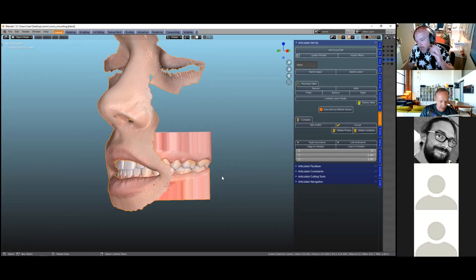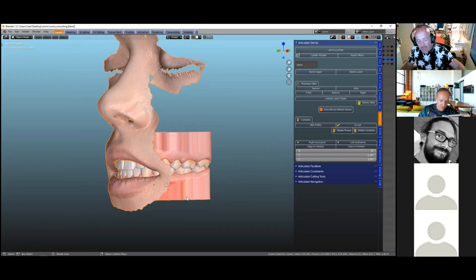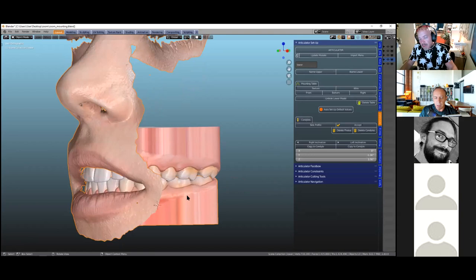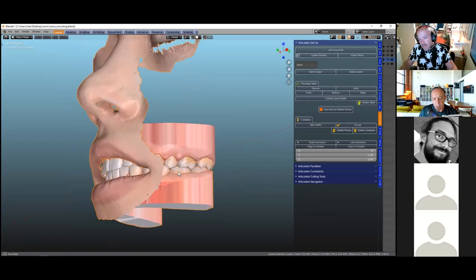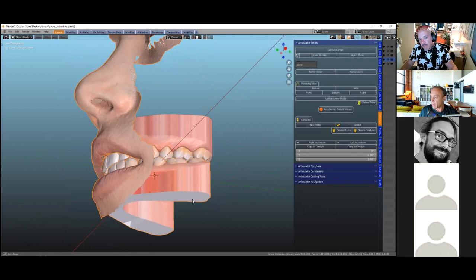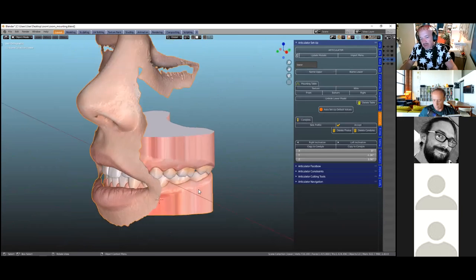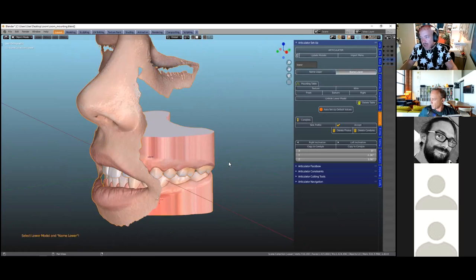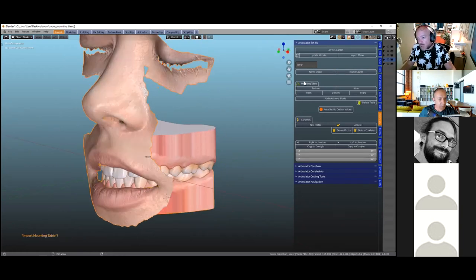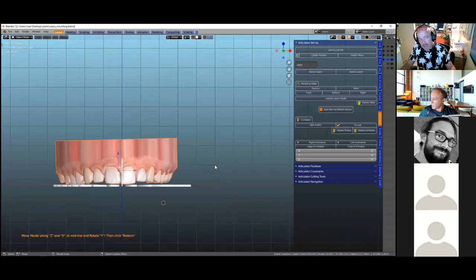We're going to join the facial scan and the lower model: shift-left-click to select the model last, then Ctrl+J to join. Shortcuts are very important — we have a shortcut key PDF file in the model designer folder. I've joined the facial scan with the lower model and I'm going to name the top model 'upper' and the face-with-lower-model 'lower', so we now have two objects in the scene.